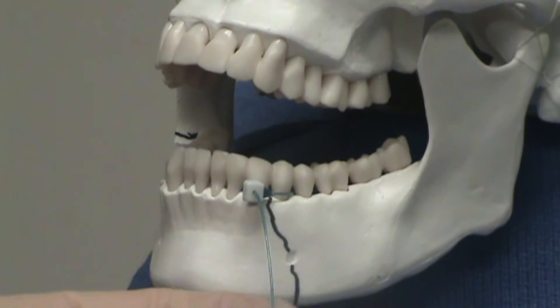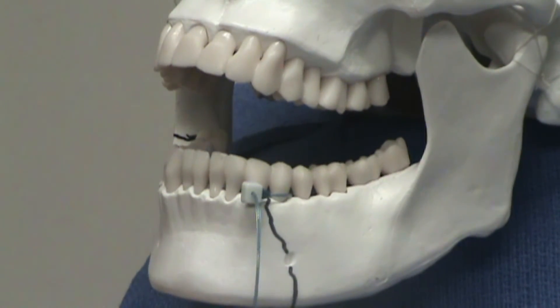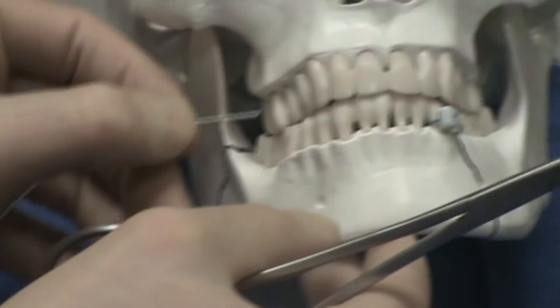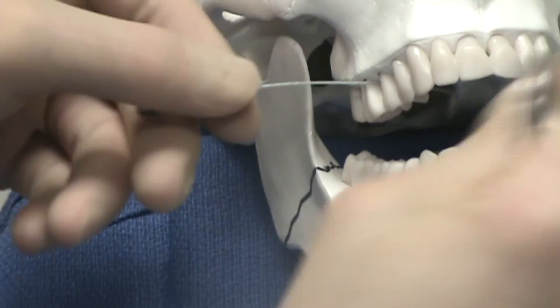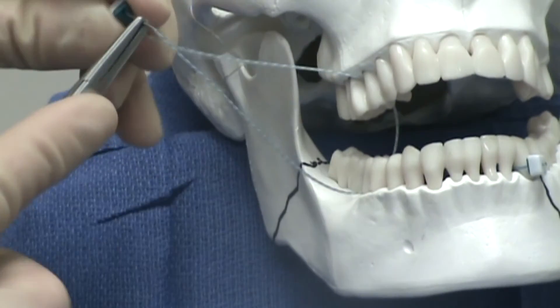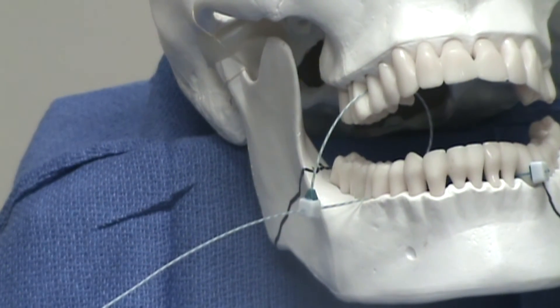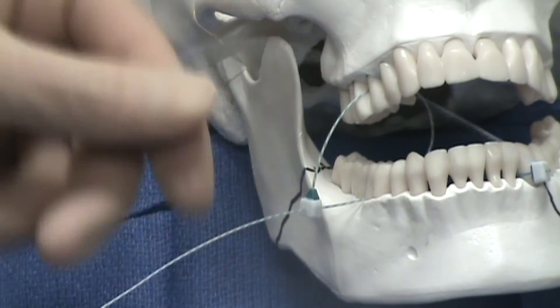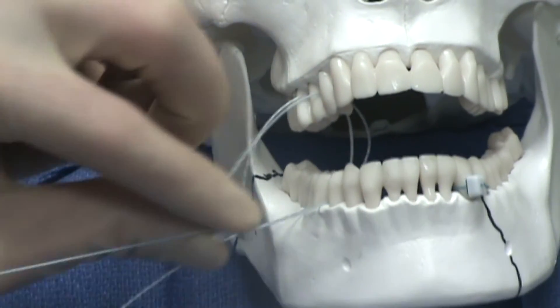The devices can also be used to secure the upper dentition to the lower dentition by placing the devices in the apical embrasure between teeth and looping the device from the upper dentition to the lower dentition prior to securing the device in the clasp. The devices in the left and right dentition must be fully applied prior to placing the patient's teeth into occlusion.